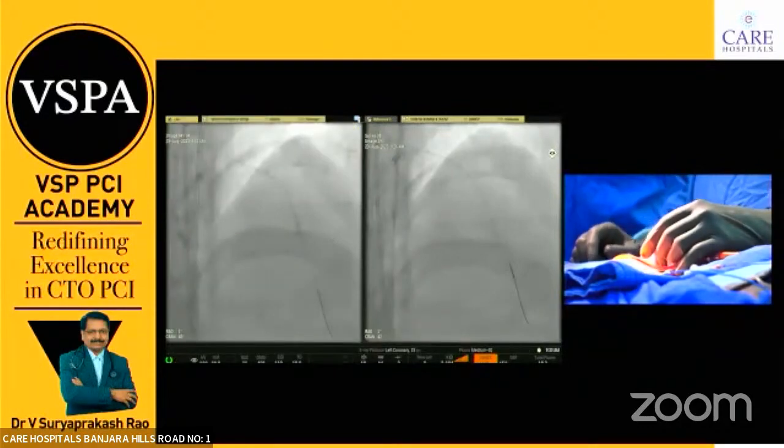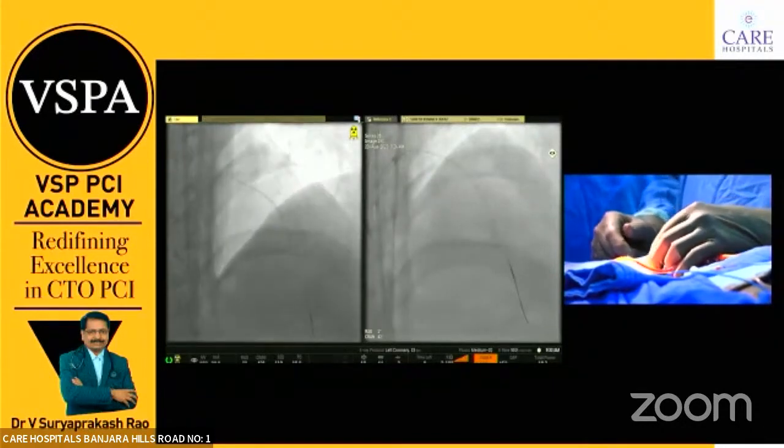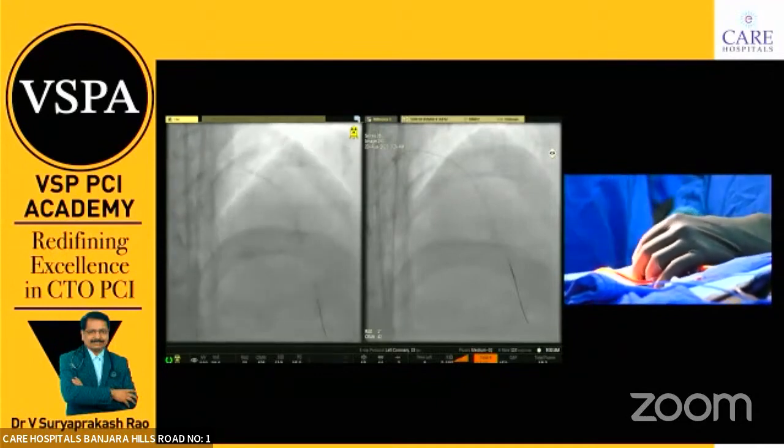Vessel looks like 2 millimeter in the distal. For better quality, she's injecting a little saline flush. Yes, distally, if you see the bookmarking in the middle portion, actually it is in the middle, there is a calcium exactly at the CTO site.